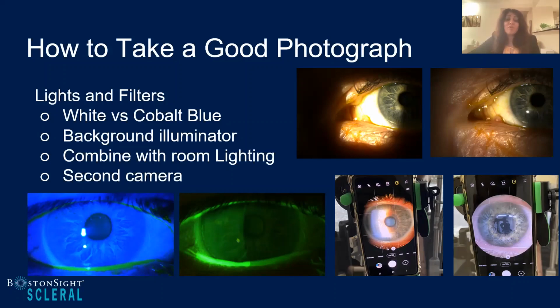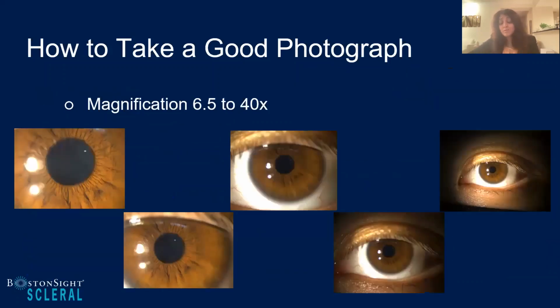It's so great for us to be able to have these baseline images to, one, track size and change over time. But again, just playing around with the different filters and illumination and brightness, and room lighting, is really important.